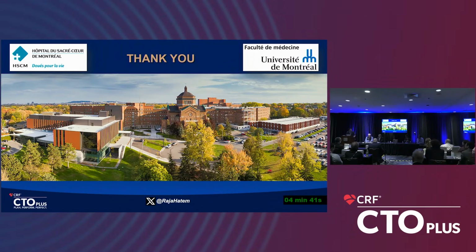Thanks, Raja. Even though these tend to be some of the most straightforward cases that we face, there's so much in this that we could unpack. One of the things, and we have a diverse audience. We have people who are just starting their CTO journey. We have people that are well into it. But one of the things that you did that was so nice was discover whether or not you're in the true lumen distally with your first wire by two things: injection with filling of the collaterals, and if you're not sure, then by exchanging for the workhorse wire, because the workhorse wire will not travel in that subintimal space, just as was exemplified by the first attempt.